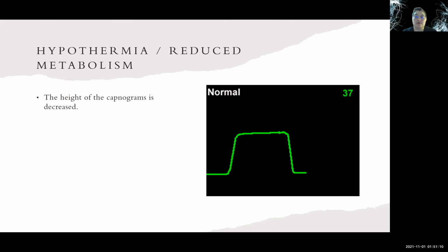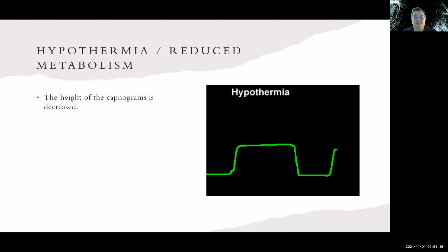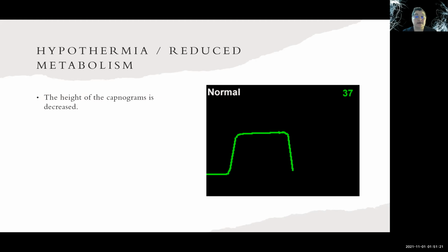With hypothermia and even reduced metabolism, we'll see some changes as well. Our frequency is going to be pretty regular with pretty regular rhythm. The height will be decreased, and baseline, usually it's going to remain at 0.